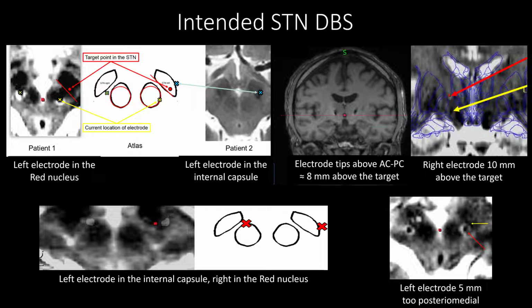Further, albeit very rarely, it has happened that a lead has changed its position after surgery, after initially having been verified to be well placed, why one might want to confirm the location of the lead again in some cases.